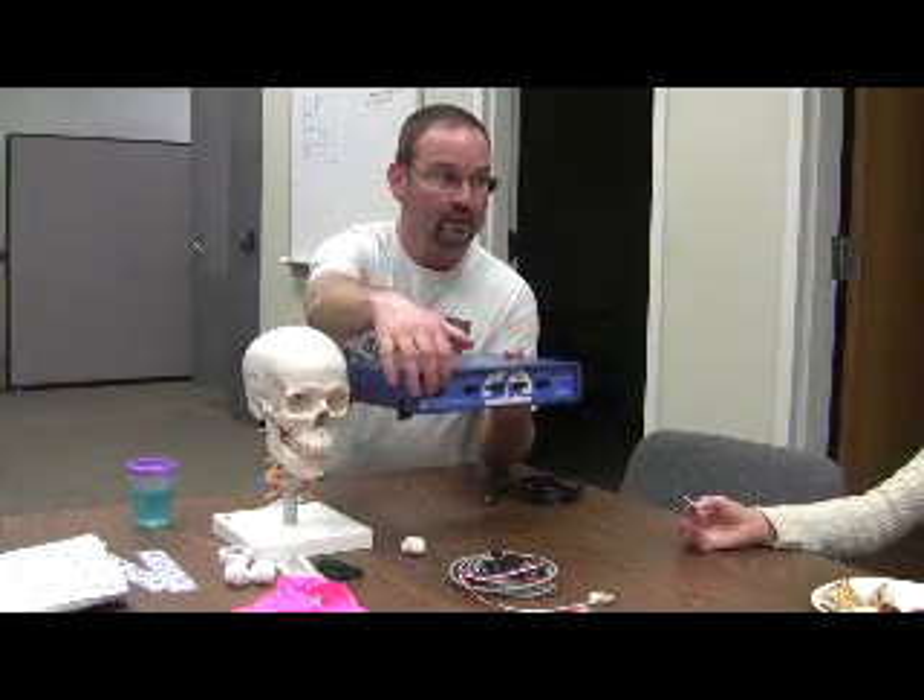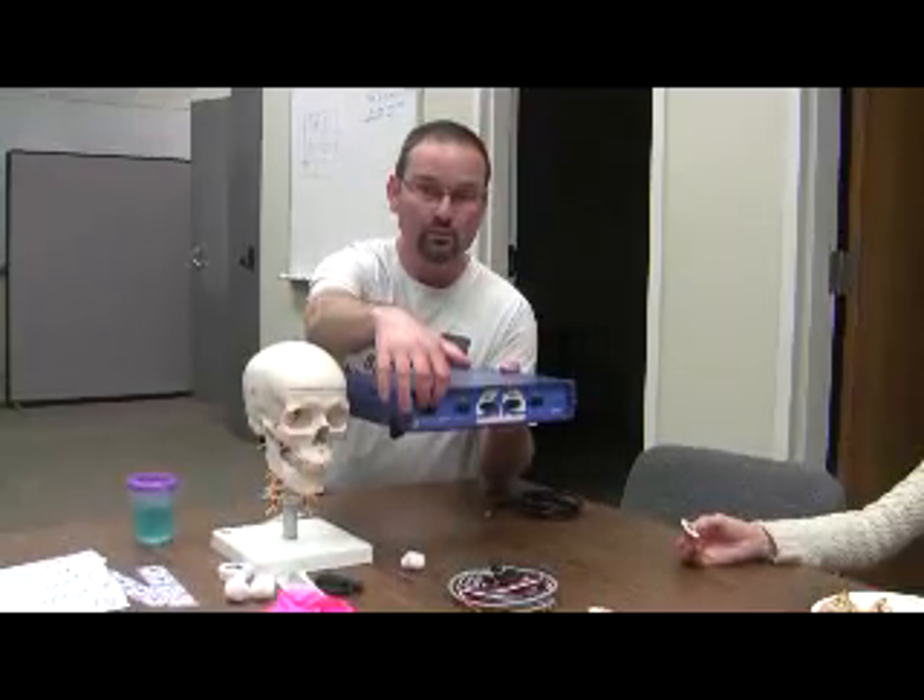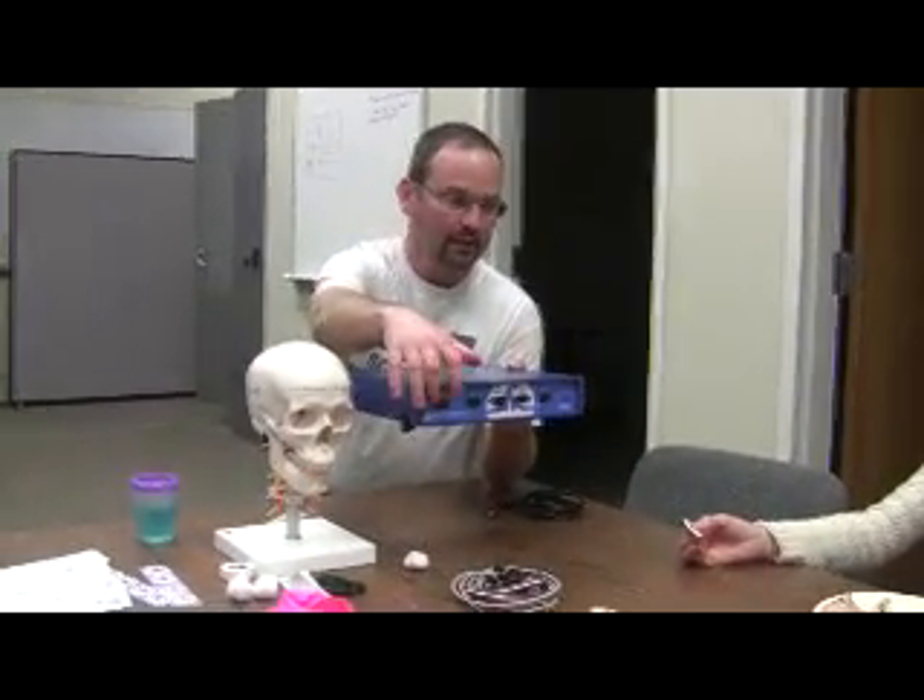It has four channels in front, and then this fifth port in the front is very useful for EEG. It's called an electrode checker — that's the label, and you'll use it later on.